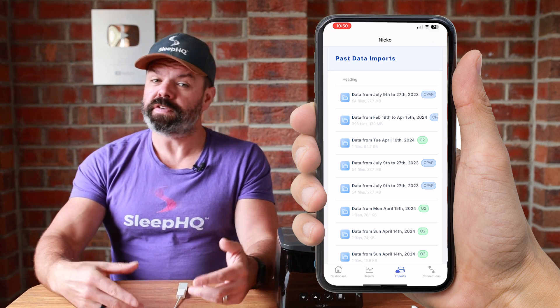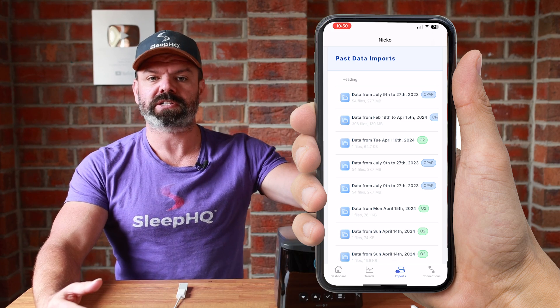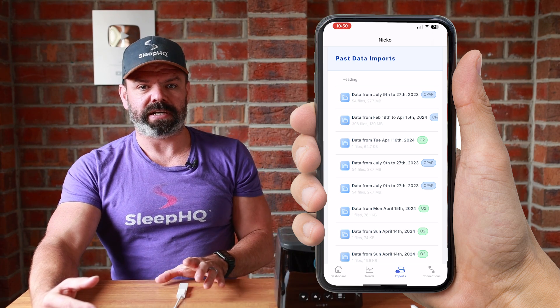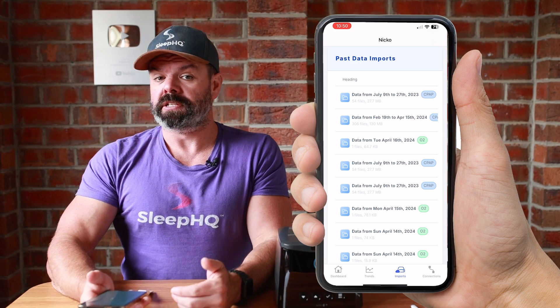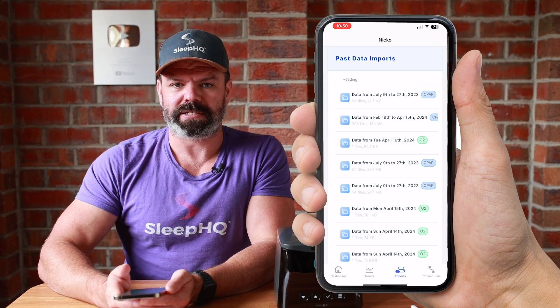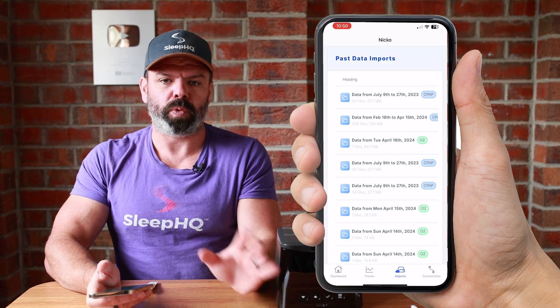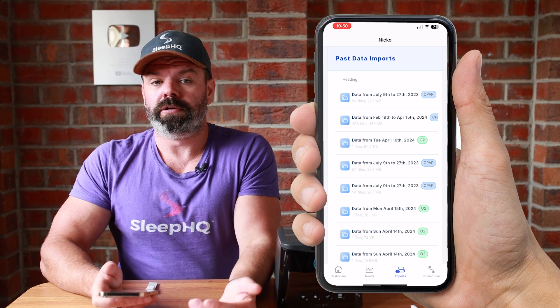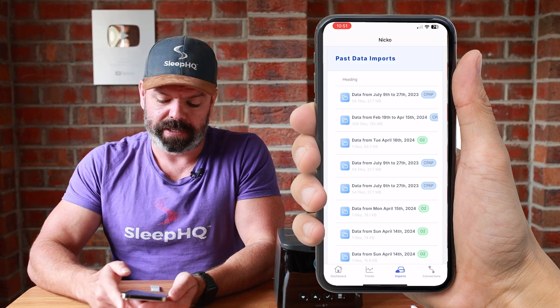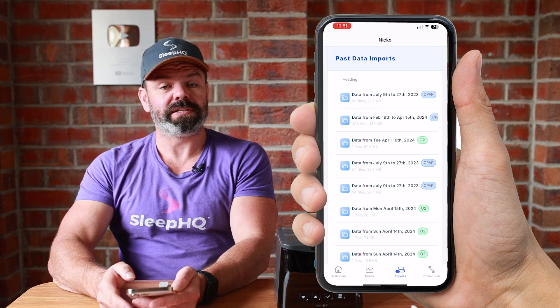This is important: if it's your very first upload with SleepHQ and you've got a laptop or PC, I recommend doing it through the web application first if you can. If you've been using a CPAP machine for many years, there'll likely be gigabytes of data on your dongle or SD card, and smartphones aren't really designed to handle that much data on upload. They can do it, but it's sometimes a little messy and takes a long time. If you do it with your PC, the first upload might take 10–15 minutes — go make yourself a cup of coffee. Every subsequent upload is much faster because we skip all those old files and only upload the new ones. But mine is uploading now — you can see it there at 36%.